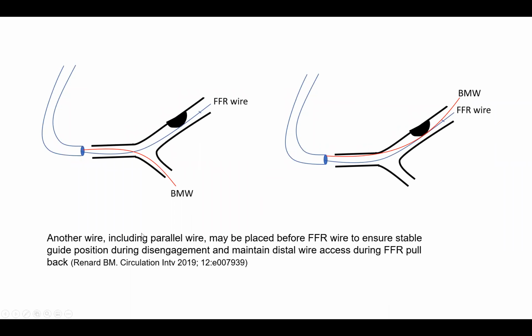So how to compensate for that? And that's an extremely important slide for interventionalists, how to measure FFR with disengaging the guide. It is best actually to double wire the coronary. And there was one major Circulation paper that recommended that as best practice for FFR and IFR measurement. So put another wire. This way you will have in that coronary 0.028 inches of wire. So when you disengage the guide, it's less likely to fly out. It's held tight by a heavier body of wires.